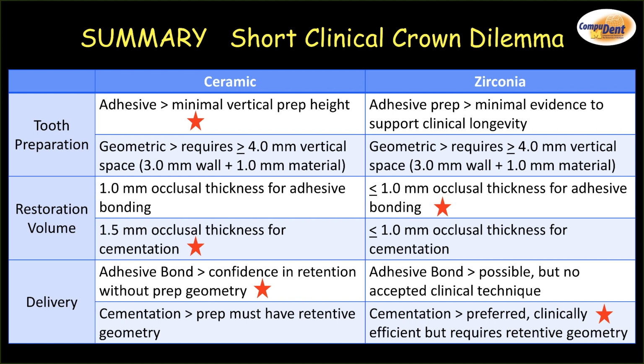especially with the CEREC system, because you don't have to worry about the temporization process. That's a real advantage, I think, for the adhesive concept, is the ability to bond something the day you cut the prep. We don't have to worry about temporization. We don't have to worry about the patient coming back a second time. So I don't think there is one right answer here.